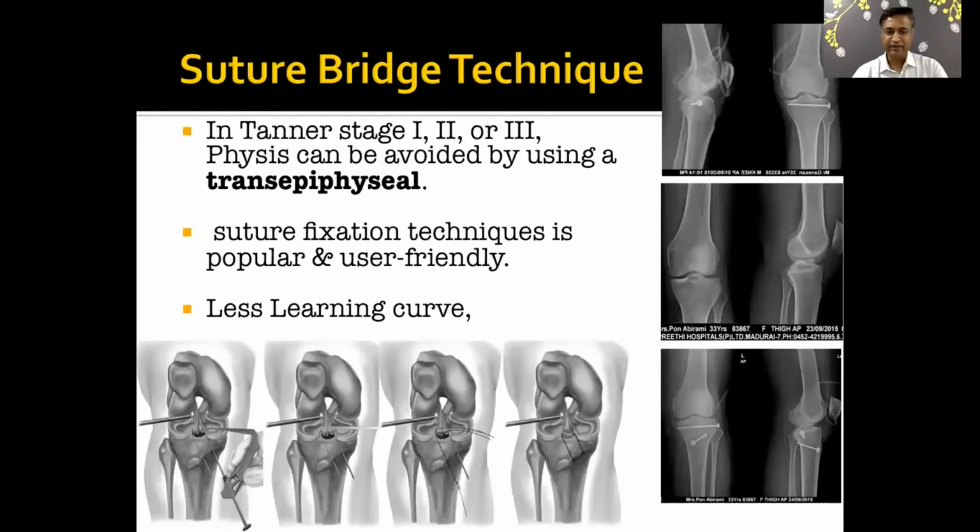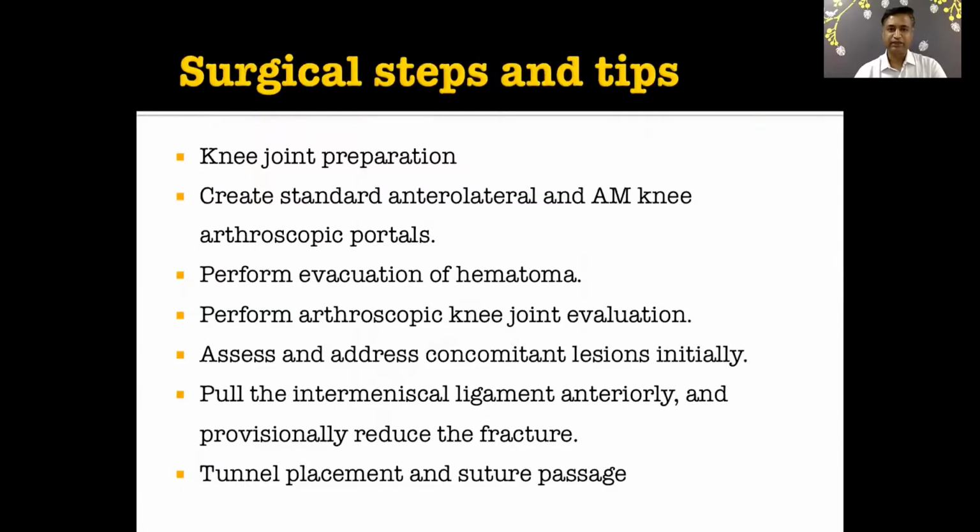It is a very simple, very reproducible technique, and also useful in the pediatric age group with open physis. So you can do a transepiphyseal fixation. So we'll see the videos of this technique. I'll go through these steps while running the video.